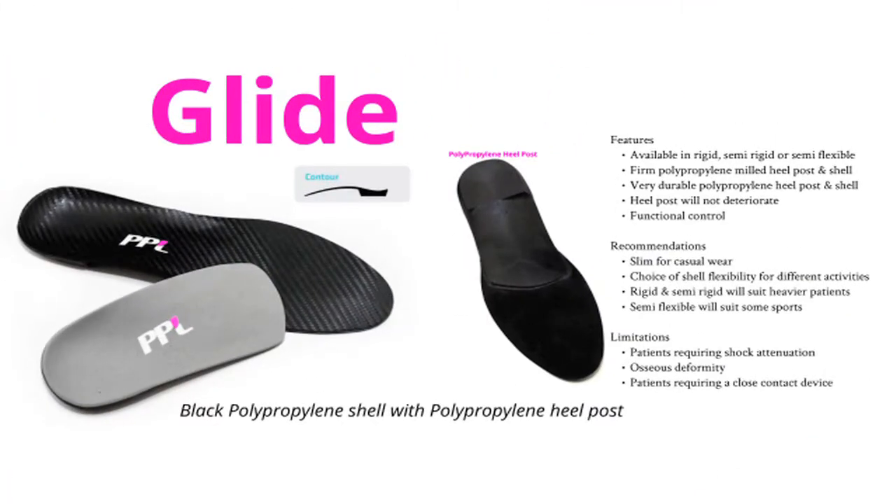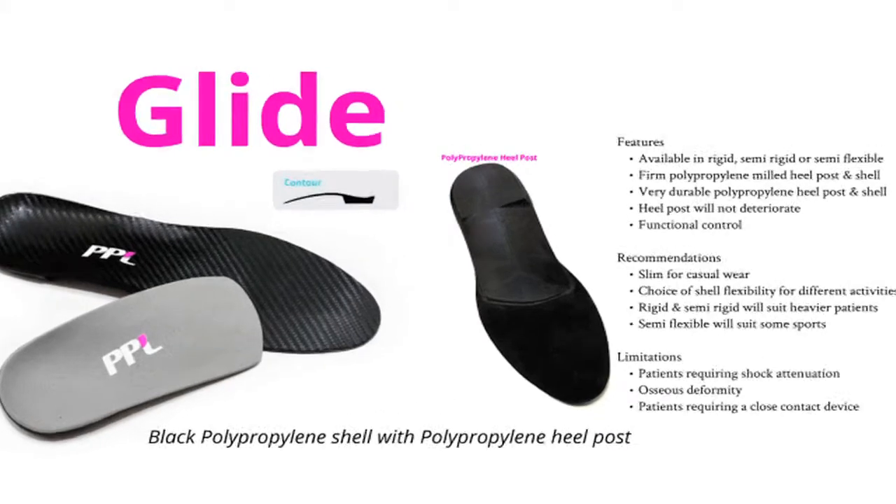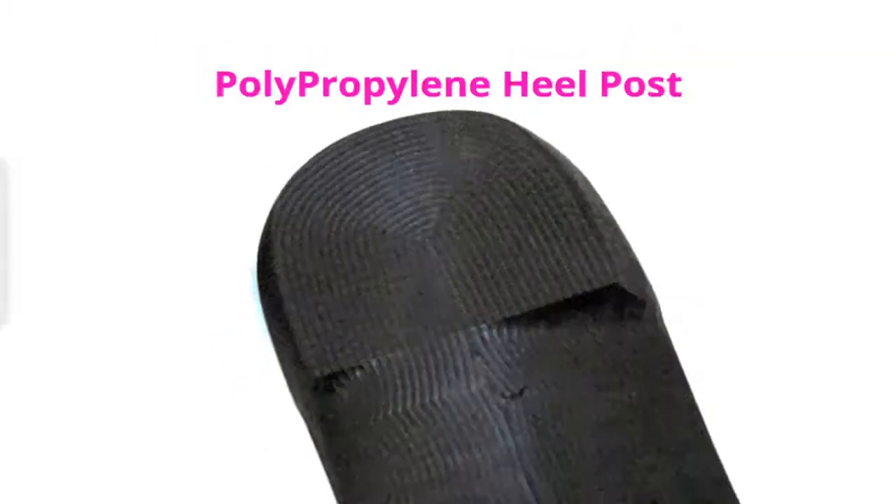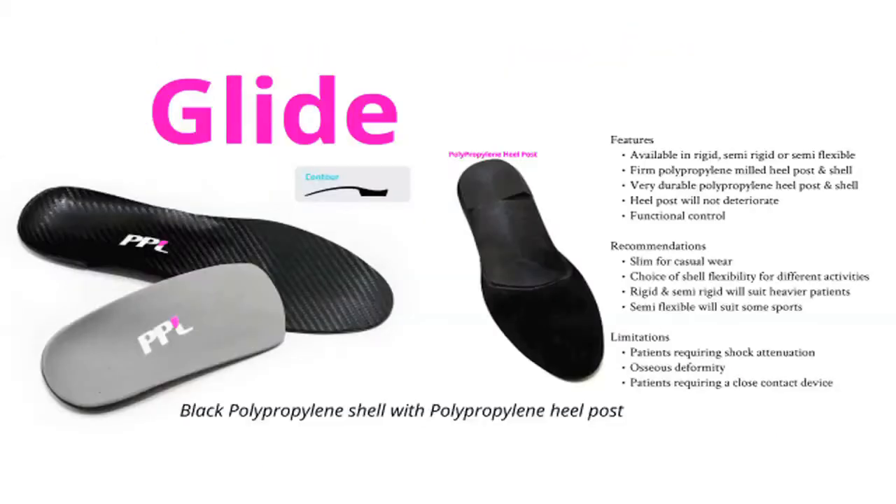Our Glide device is manufactured from black polypropylene with a polypropylene heel post. Here you can see the polypropylene heel post. As with all of our polyprop devices, you have the option to order different shell thickness in the form of rigid, semi-rigid or semi-flexible depending on your patient's requirements.